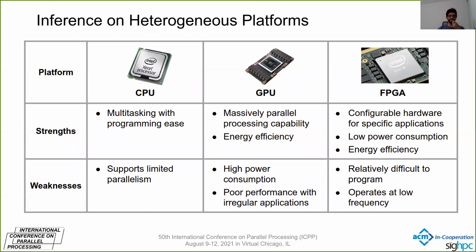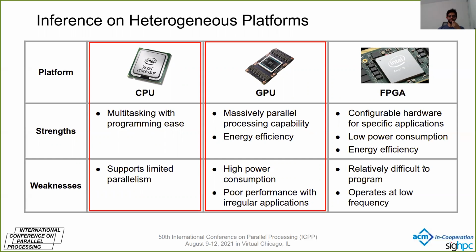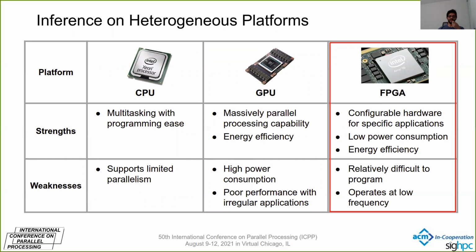Inference, which is comparatively less computationally expensive than training, is implemented via OpenCL and evaluated on CPU, GPU, and FPGA. CPUs and GPUs with their high processing capability are appropriate for computer tomography applications in hospital settings, while FPGAs operating at low frequency and consuming low power are appropriate for computer tomography applications in telemedicine.